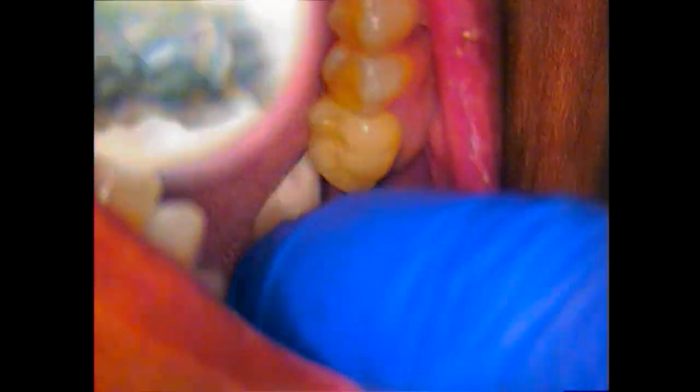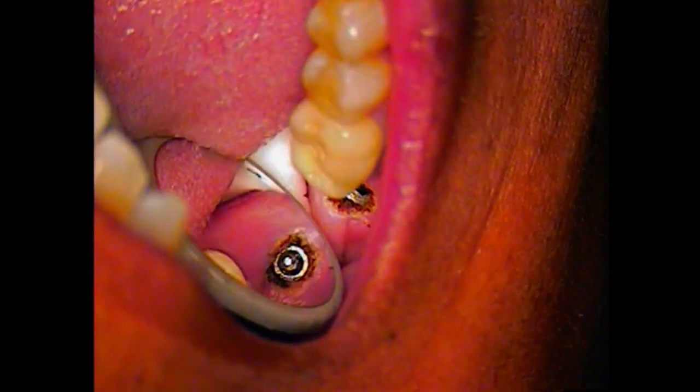I'll just go right alongside our abutment. Here we go, our cotton roll. There we go. That's good. And we just dry that off. So this is our final.